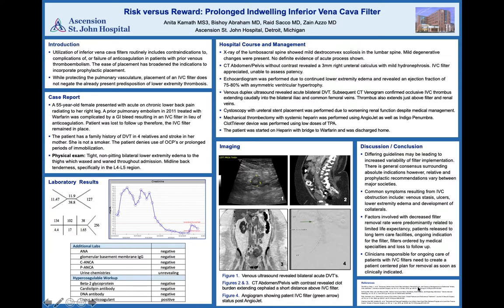Common presentations of inferior vena cava filter obstruction include unilateral lower extremity edema, unilateral DVT, venous stasis, and development of collaterals. Our patient presented with the rare symptoms of bilateral lower extremity edema and renal dysfunction, which eventually improved after intervention. In this case, the patient received an IVC filter due to a contraindication to oral anticoagulation. This is a guideline widely accepted by most major societies.